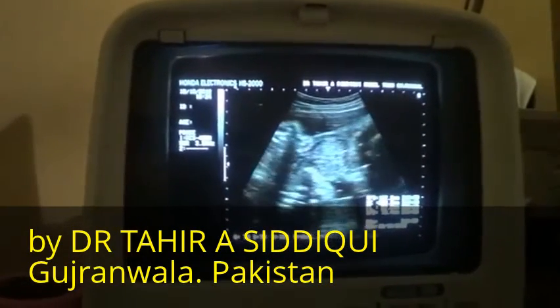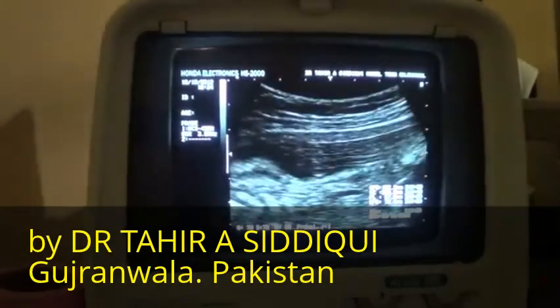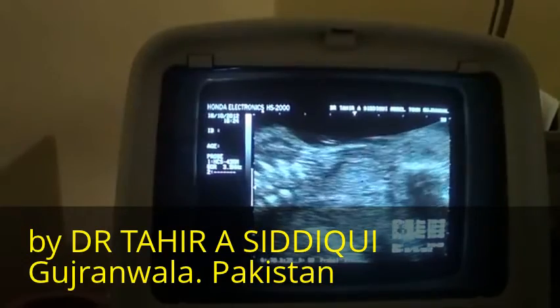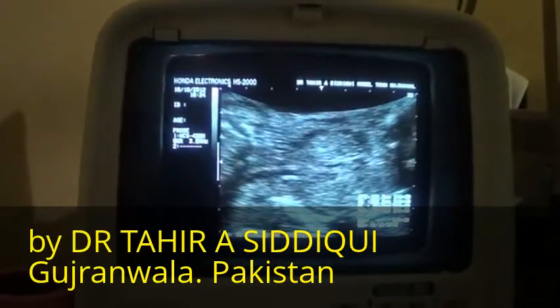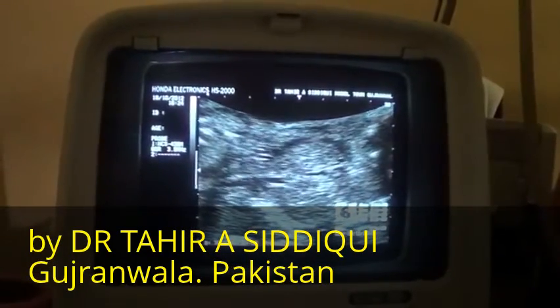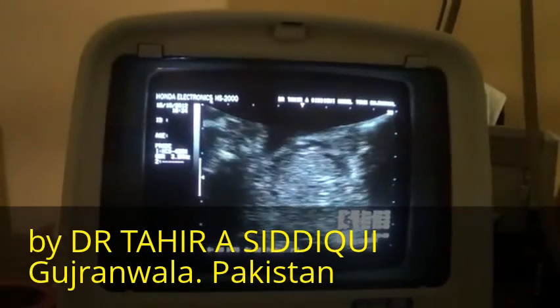Now, I am going to magnify this mass, and then I would like to study it. See, it's a bilobed shape of a mass with a vessel passing through the center of it. There we are.